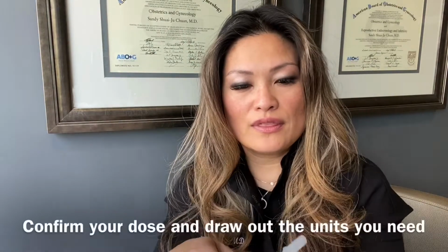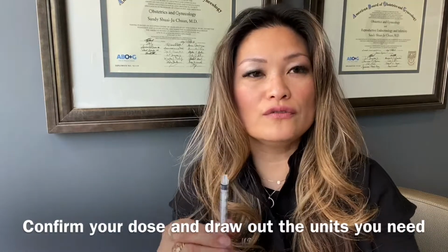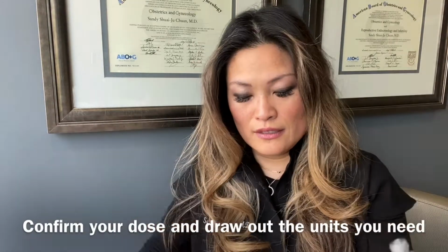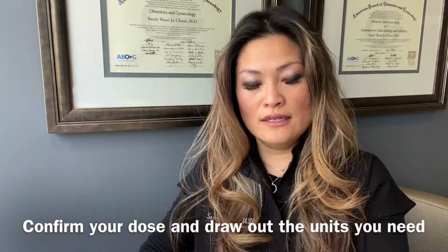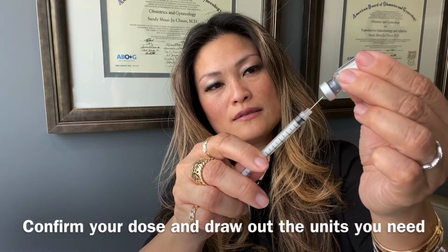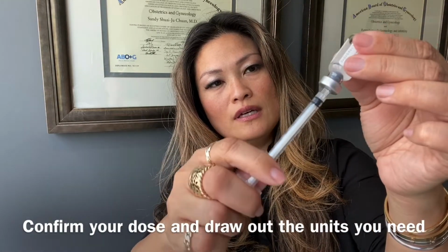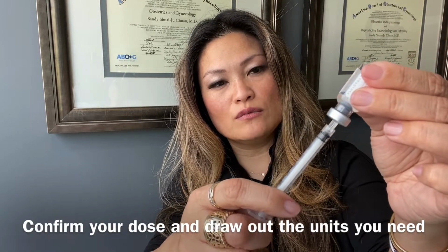So then with that, if you're ready, let's say you're going to be doing 150. So same thing, certainly could clean it again because you're poking it with a needle again. So I always say, clean it, clean it, clean it. Take this, inject it in. And you're not going to be able to see, this needle is really tiny, so you won't see the needle in the fluid, but it'll be in the rubber plunger.